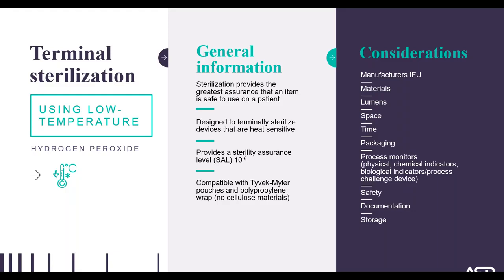Is there dedicated space to clean, dry, and package the devices? Is there storage space? Documentation, what will be used? Will you do a manual log, or will there be an automated system using instrument tracking or another automated system?